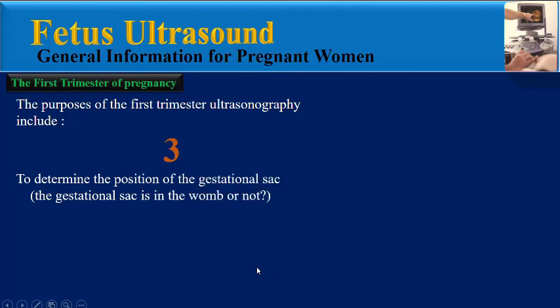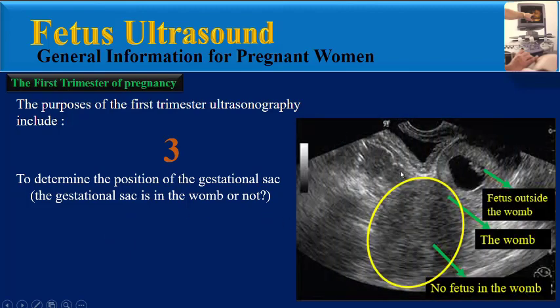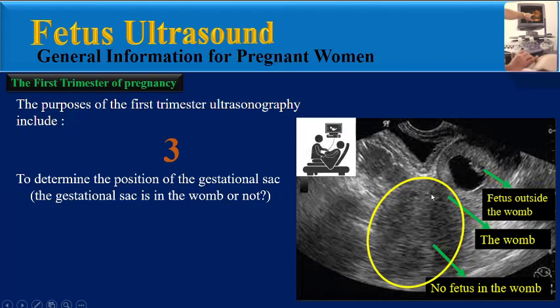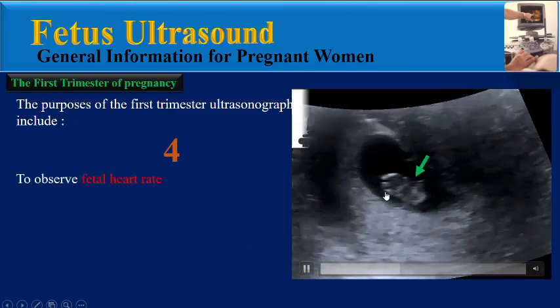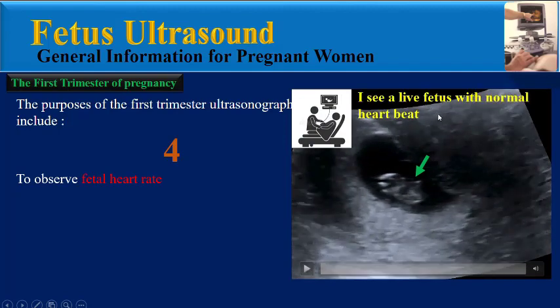The third purpose is to determine the position of the gestational site — whether the gestational site is in the womb or not — like this transvaginal image where we can see the womb but no fetus inside, and there is a fetus outside the womb abnormally. The physician reports: the womb is empty and the pregnancy sac is seen outside the womb. The fourth purpose is to observe fetal heart rate, like this fetus where the physician reports: I see a live fetus with normal heartbeat.